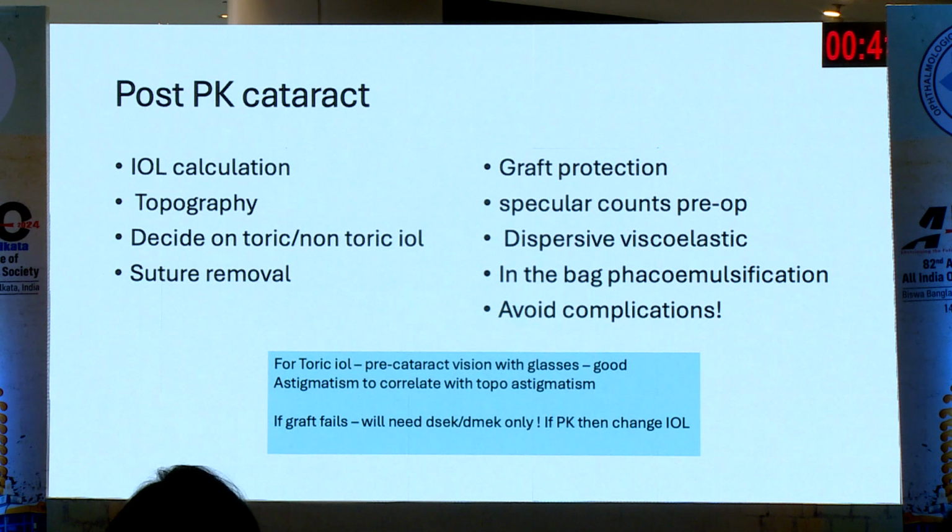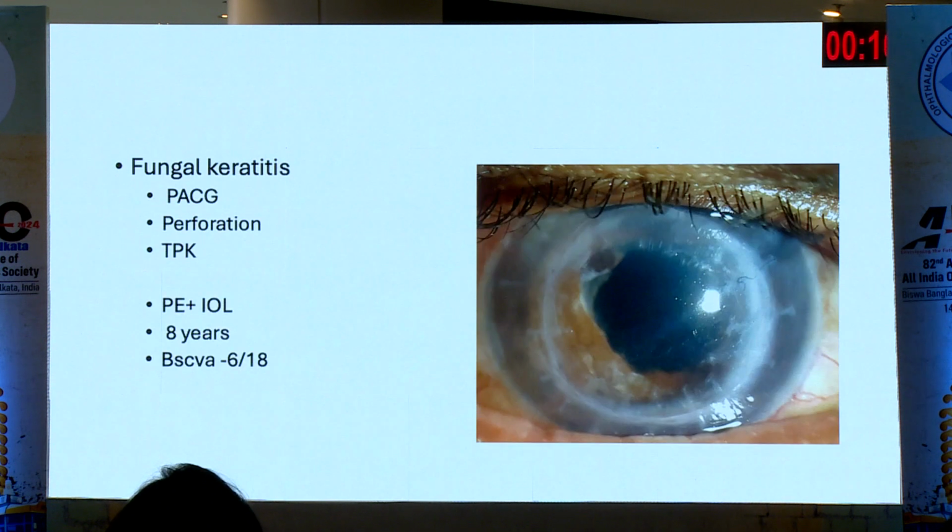If the patient was using contact lenses for best vision prior to cataract surgery because of the graft being irregular, obviously he will continue to use contact lenses post-operatively unless you address the irregular astigmatism either using a topo-guided treatment or resuturing the graft and then planning cataract surgery subsequently, or combining a PK or an anterior LK to reduce the astigmatism with the cataract surgery.